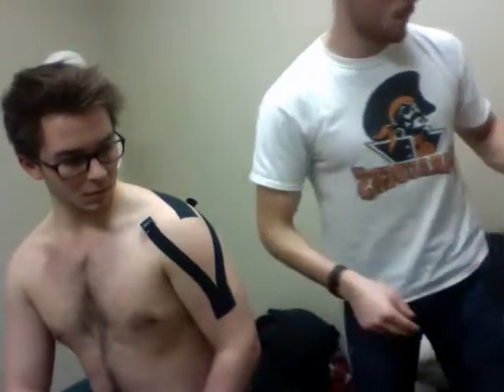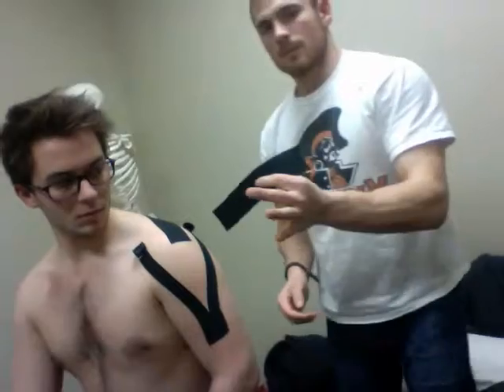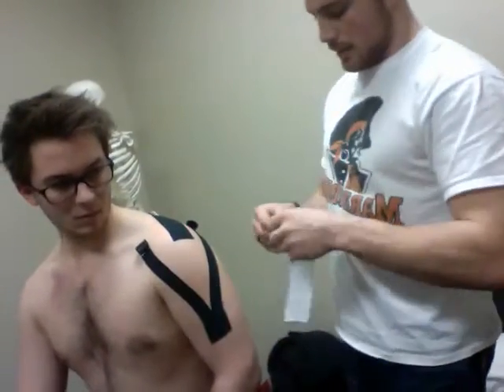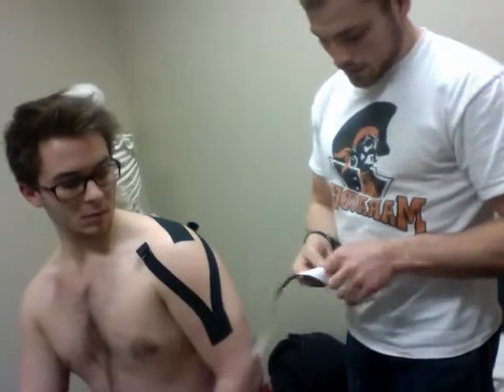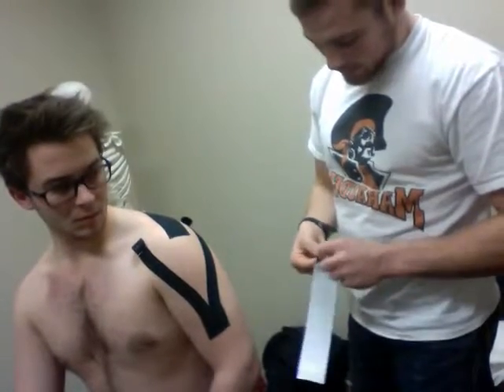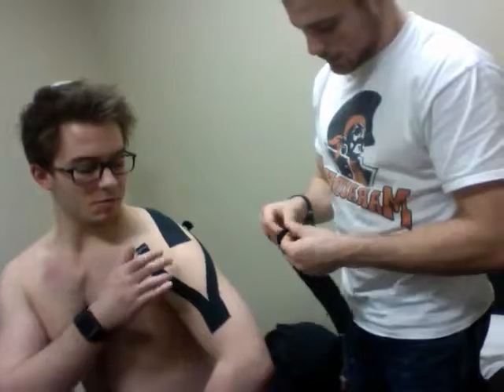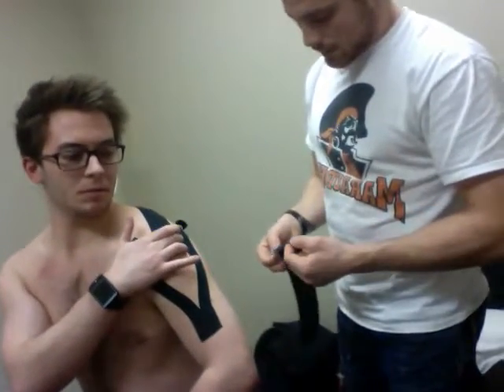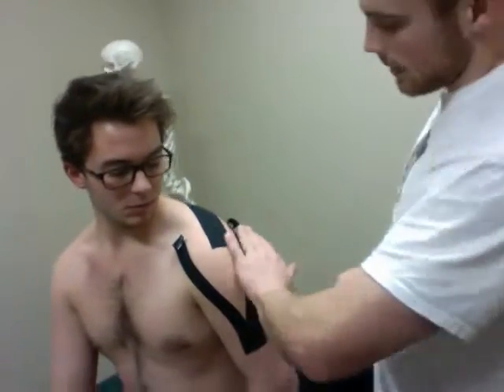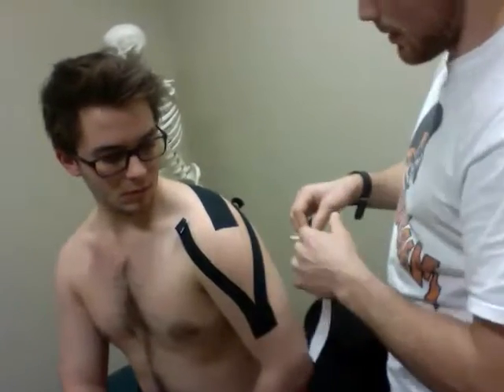The last application I'm going to apply here is an I-piece of tape — just a straight piece — and we're going to anchor it across like this. Now I want to ask my patient where exactly he is having the most pain. Go ahead and point to where you're feeling the most pain with that rotator cuff tendonitis. That's the point where I'm going to apply my mechanical correction to the tape — right here — so that's where I'm going to apply upwards of 50% stretch with a downward motion.